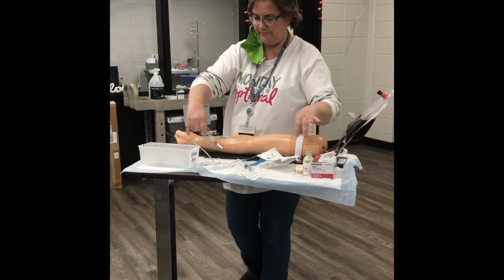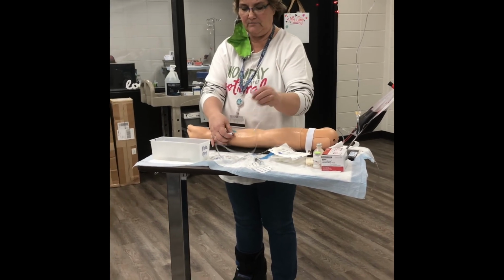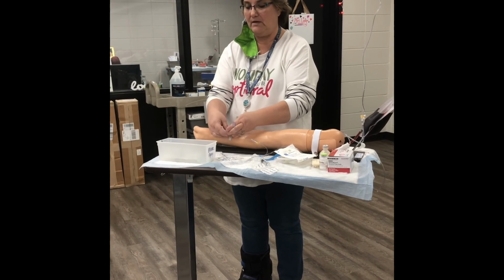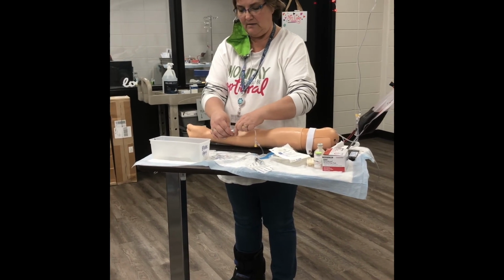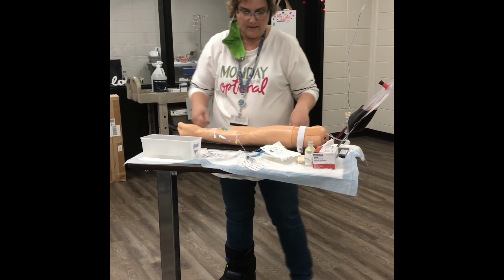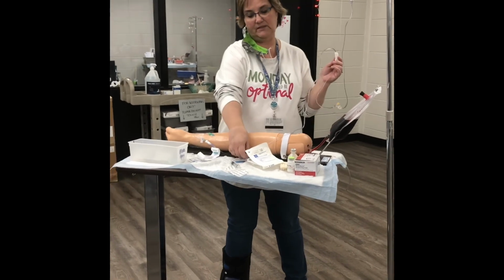All right. I'm going to clean the end of this with alcohol because I don't know what all it touched. Well, actually, I'm going to take this off first. And then clean this with alcohol. Again, you just push and turn till it's hooked up. All right. This is the worst. This is what messes students up.